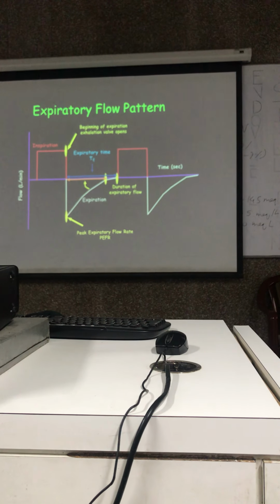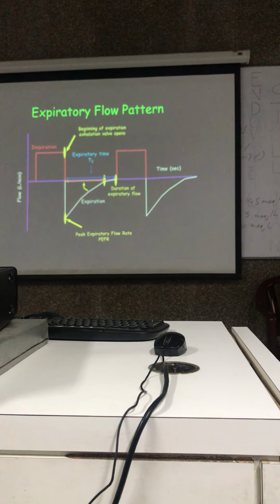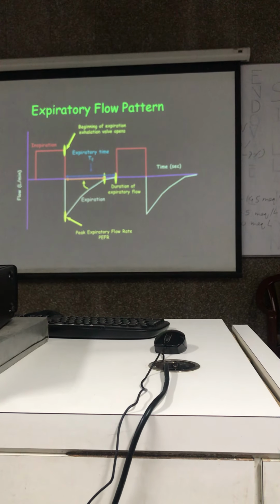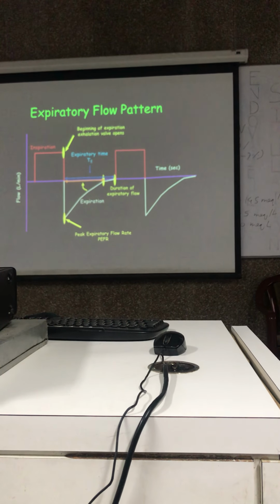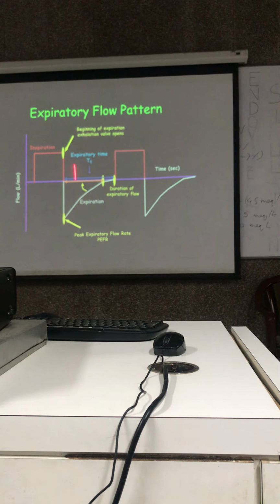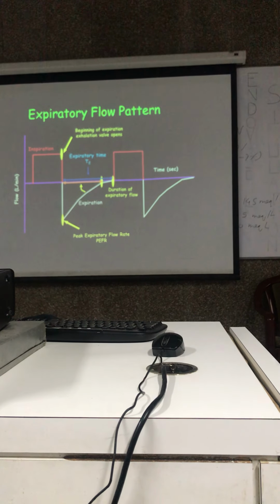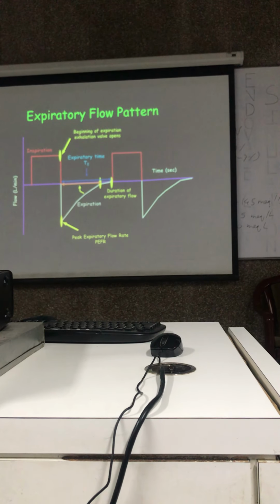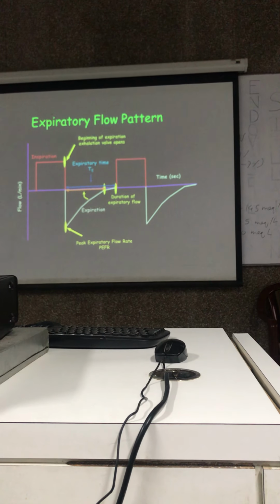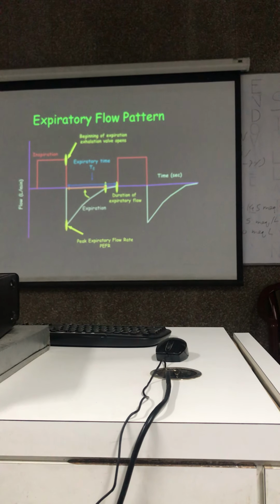If it falls short, and we will show you in various graphics later on what happens if it falls short, what you will be able to diagnose if there are various short levels in this particular case. Most important in this situation is that you need to notice that the flow rapidly changes direction from positive to negative when the inspiratory valve closes and the expiratory valve opens. You will see a sudden, straight linear pattern here, showing you that this is when expiration takes place.